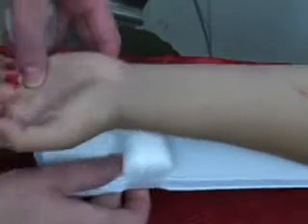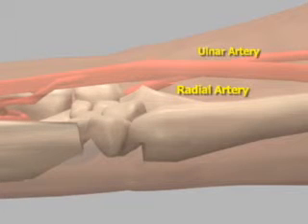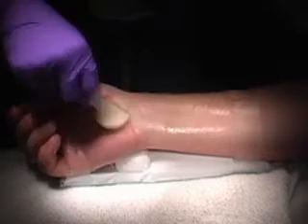Prior to sterile field preparation, position the wrist. By positioning the wrist in dorsiflexion, the radial artery is brought in closer approximation to the skin. This can be instrumental to the success of the procedure. Proper positioning can be maintained by placing a roll of gauze under the wrist or by using a specially designed arm board and securing the arm with tape.